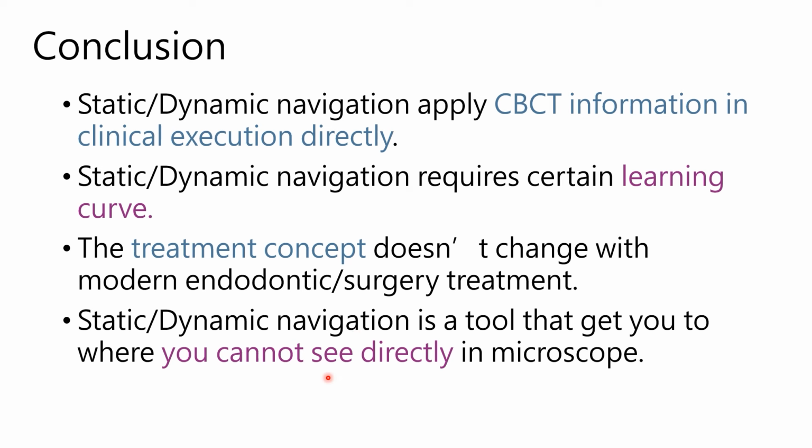The static navigation and the dynamic navigation get you where you cannot see directly in the microscope. Maybe you can imagine it, but you cannot directly see it. And it tells you the way. That's what navigation means.